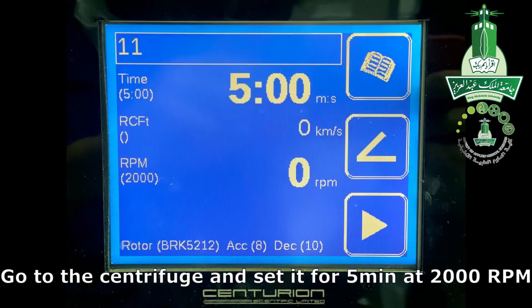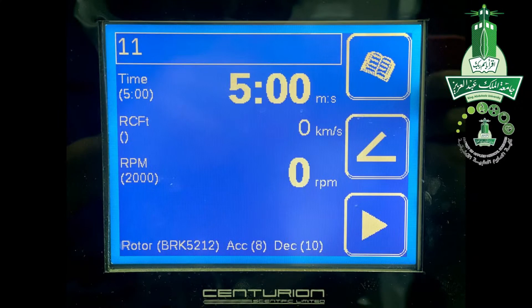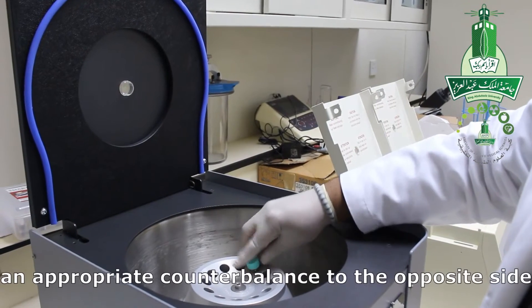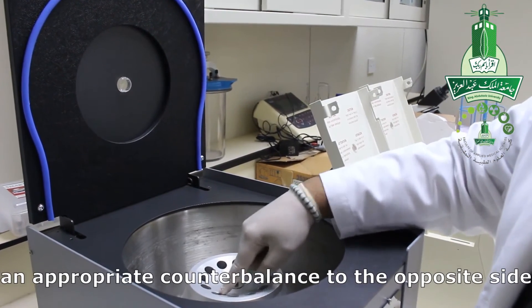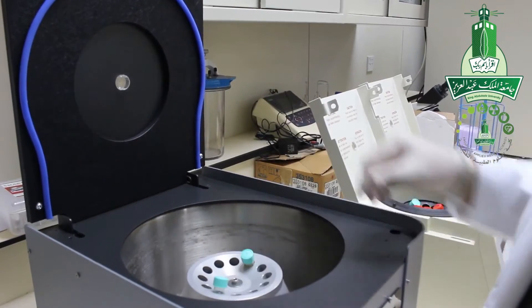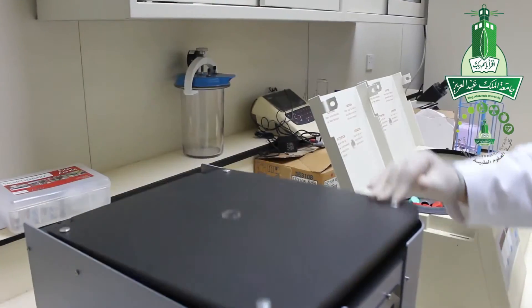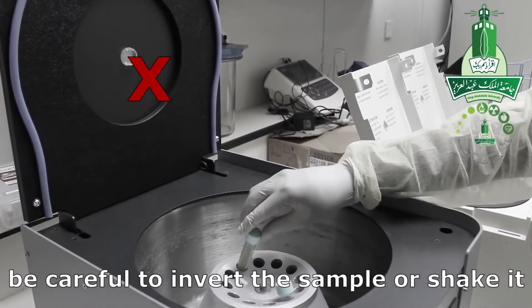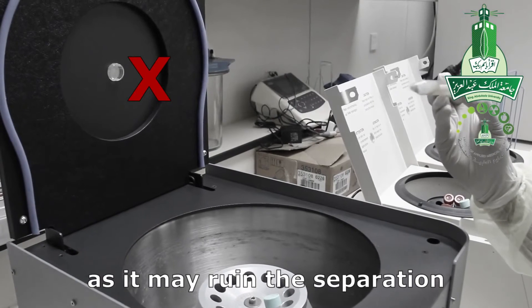Go to the centrifuge and set it up for 5 minutes at 2,000 rpm. Set your sample and place an appropriate counterbalance on the opposite side. When removing your sample from the centrifuge, be careful not to invert or shake it, as that may ruin the separation.